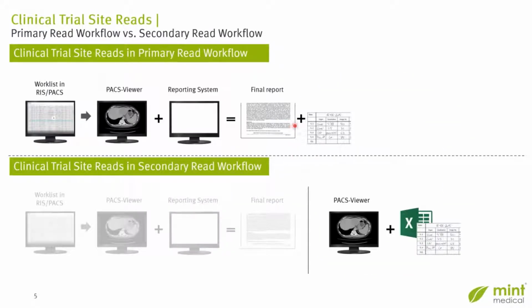Let us now specifically focus on the clinical trial site read, and first we would like to present you two different scenarios, how those site reads are organized. First, some institutions perform their site reads in a so-called primary read workflow, meaning they just do their routine read, and within this process, they also document all requirements for the clinical trial assessment within an Excel-based tumor log or even with paper and pen and dedicated forms.